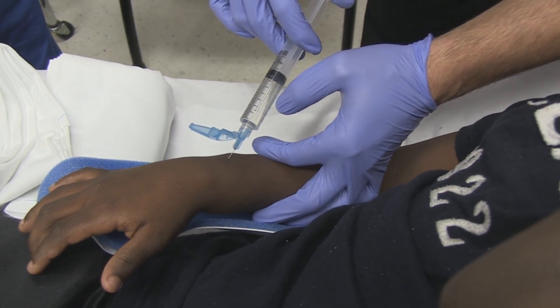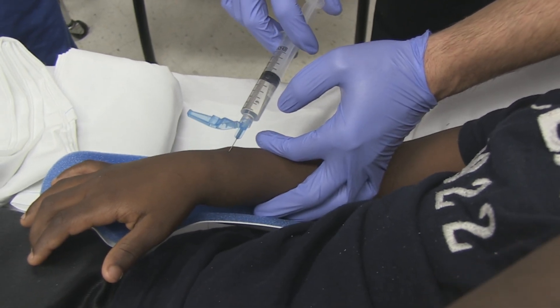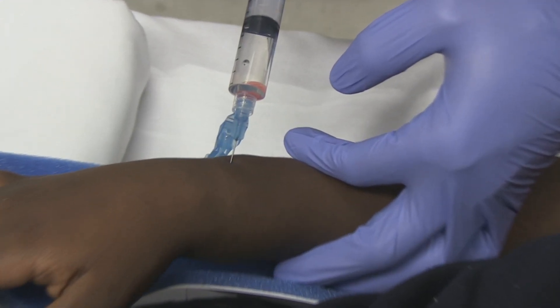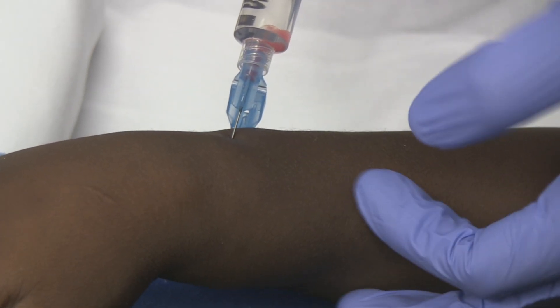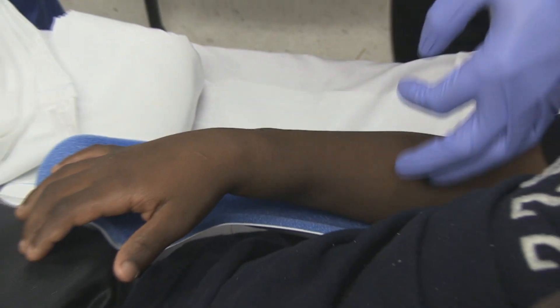Ideally you aspirate back and get some blood — yeah, but that doesn't happen every time. Most times you'll get a little blood. Again, it should flow easily. If you blow up the surrounding soft tissue, you know you're still outside of it. But it should be enough.